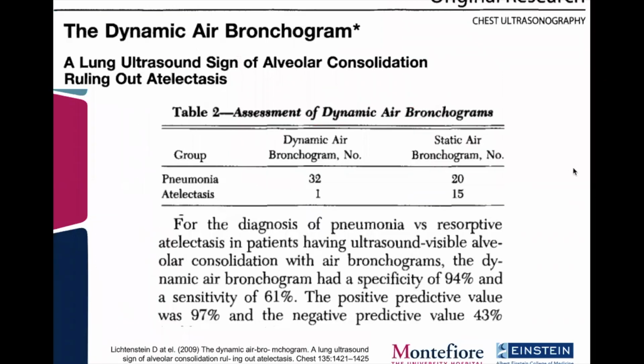So now let's move on to how ultrasound performs for pneumonia. So the dynamic air bronchogram, published in 2009 by Lichtenstein. This was a prospective study of 68 mechanically ventilated patients, all of whom underwent bronchoscopy for evaluation of an alveolar consolidation. So 52 patients were clinically diagnosed with pneumonia.